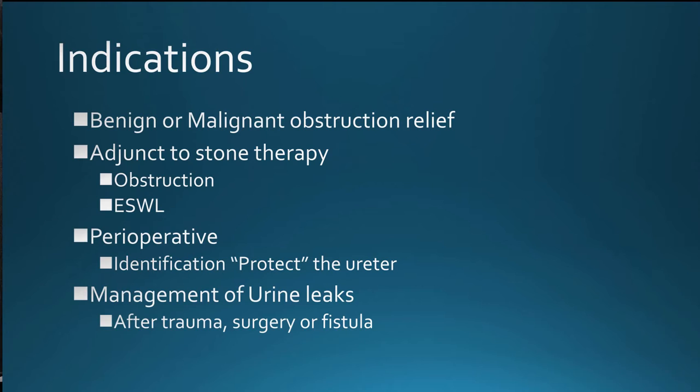And then finally, stents are placed for identification of the ureter in the setting of surgical procedures, particularly gynecologic procedures. They allow the ureter to be more easily identifiable and therefore protected. But the vast majority of stents are placed for ureteral obstruction and stone management.